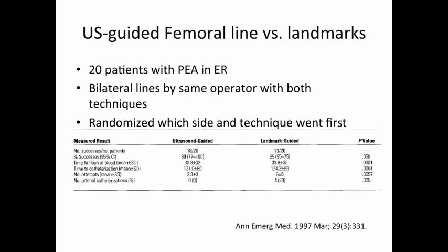I'm sure you guys have at some point been involved in code lines, and you know that they're hard because there are people at the top of the bed pounding on the patient's chest, so things are moving all over the place, and it may be harder to access or more likely to develop complications. This was a smaller study, about 20 patients who arrived to the ER in PEA arrest.